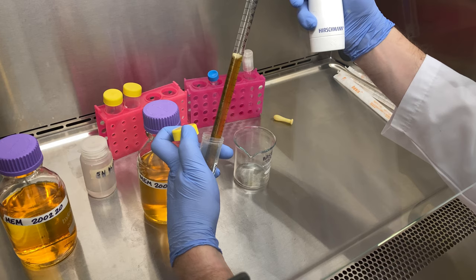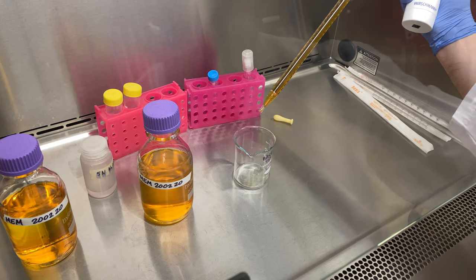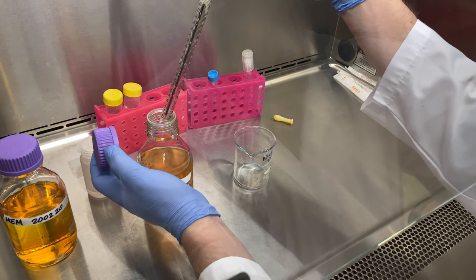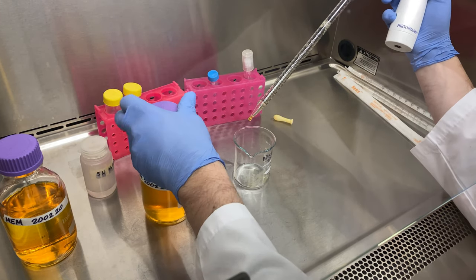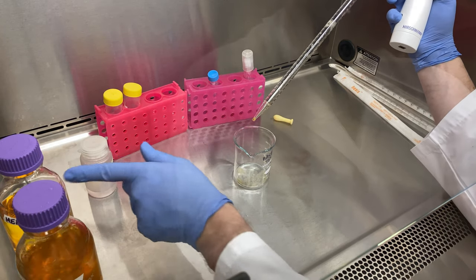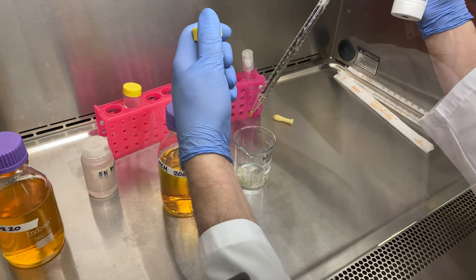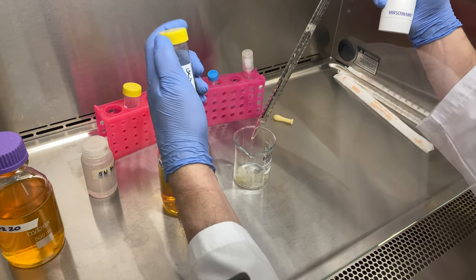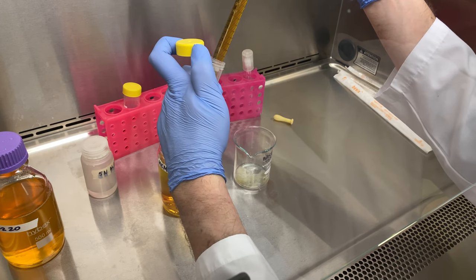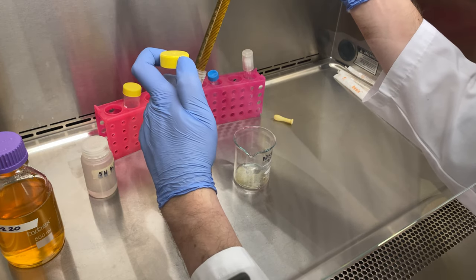The bovine calf serum contains growth factors. These growth factors are necessary for our cells to divide. Without serum, there's no subculturing because your cells will not expand in confluency. As a general rule, you will always add your serum last, especially when it's fetal bovine serum. Serum is quite expensive, and if somehow you messed up your solution, you don't want to waste any of your serum. That's why I'd always recommend adding your serum last.